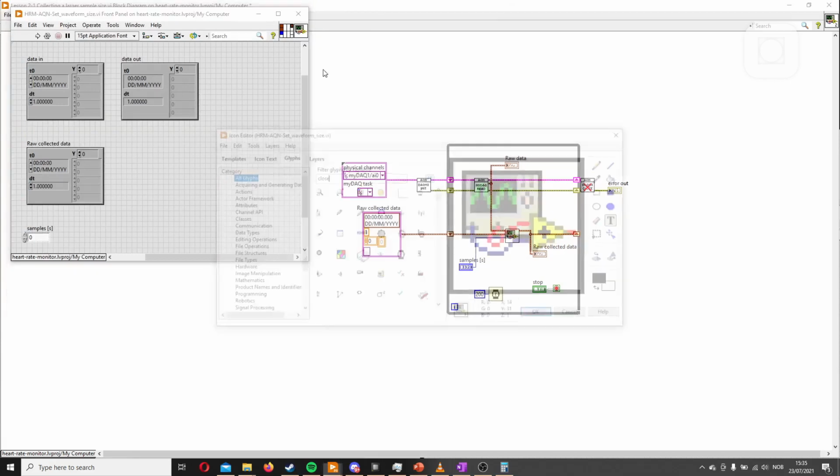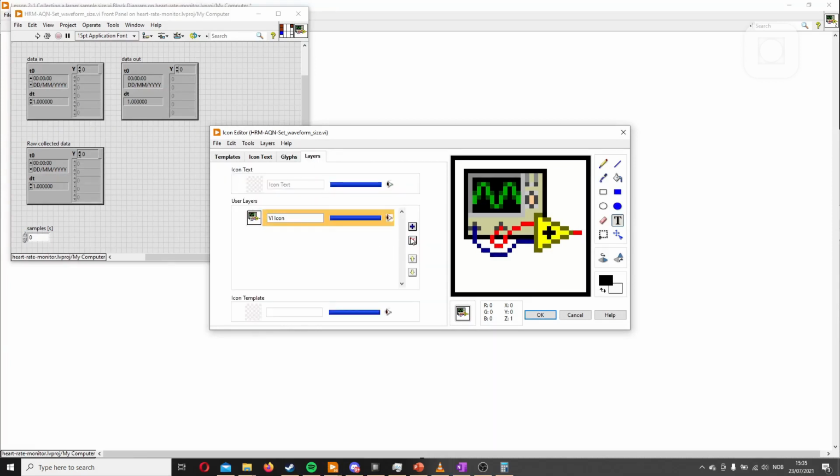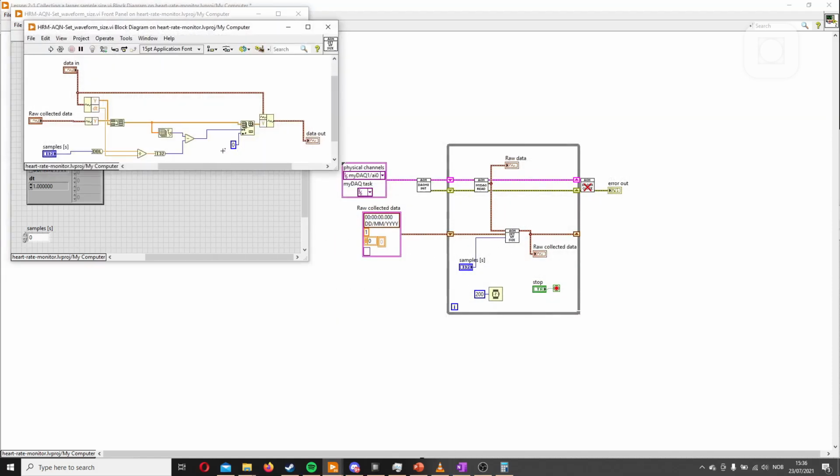And then we can edit this one too, edit the icon, case close from last lesson. And we'll actually just do the same as we did with the other ones. Set. And then we'll use an abbreviation, waveform size. Ooh, that becomes too far down. Let's do another trick in the book, which is just to start the new one here, waveform, boom. So we can control the distance they are. So we have room for more. And there you go. We're in set waveform size. Okay. So we've done this. We can look in here, maybe clean it up a little bit.